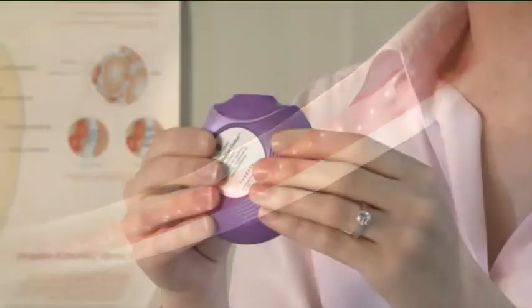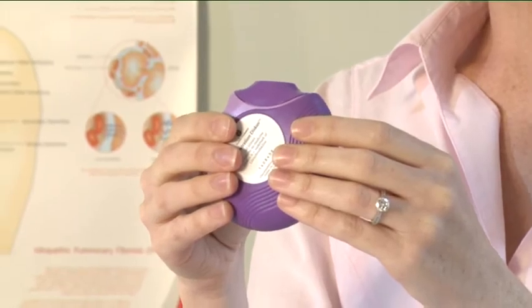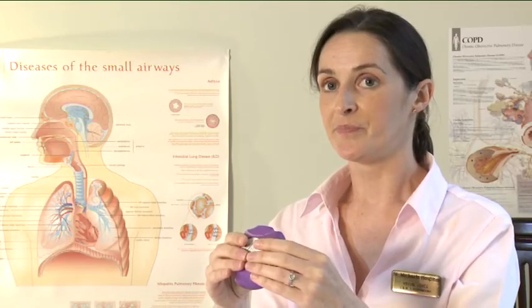Remove the discus from your mouth. Hold your breath for about 10 seconds or for as long as is comfortable. Breathe out slowly.